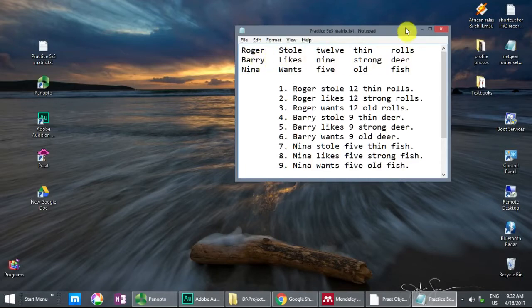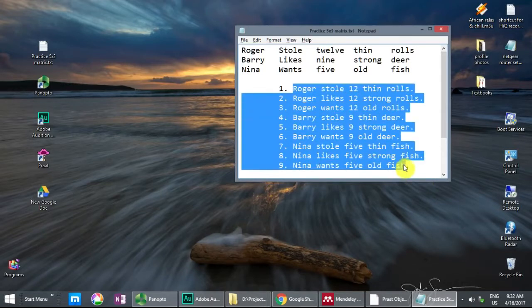So I do have 3 basic sentences, but I'm going to use a procedure which is described quite well in the ICRA paper, how to concatenate enough sentences so that I have each co-articulation recorded at least once. So what I mean by that is, I'm going to record these 9 sentences.